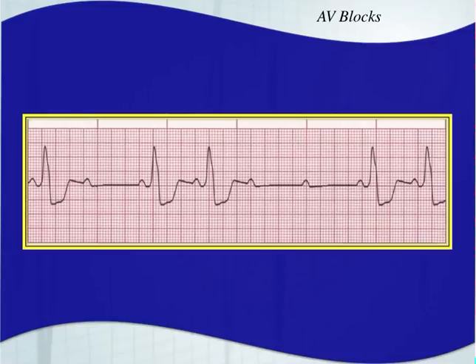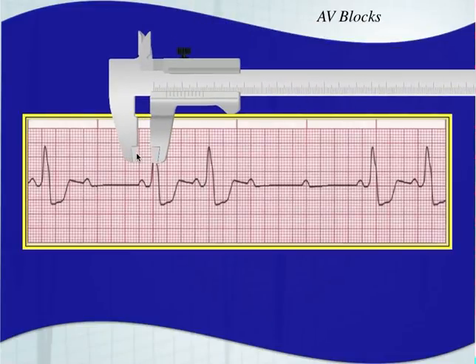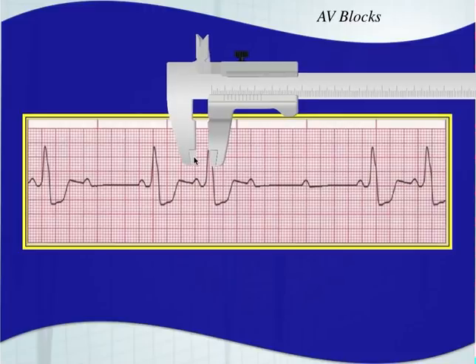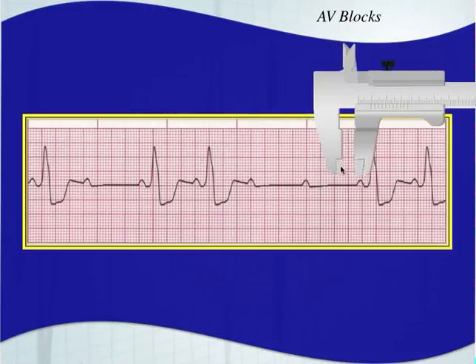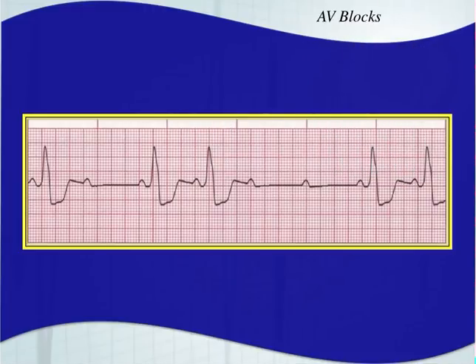Another example: is our PR interval a constant length? Yes, it is consistent where we have one. Second question — do we have dropped beats? Yes: P waves with no QRS, P wave, P wave. This is a second degree type 2, Mobitz 2.